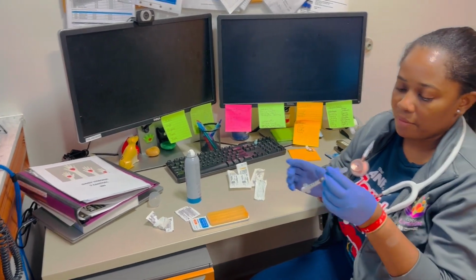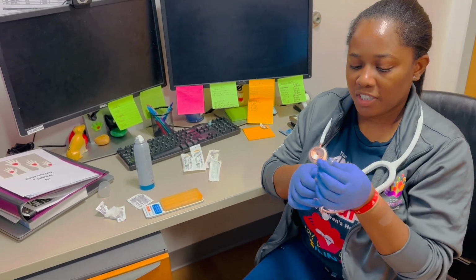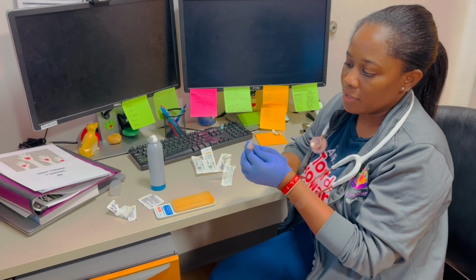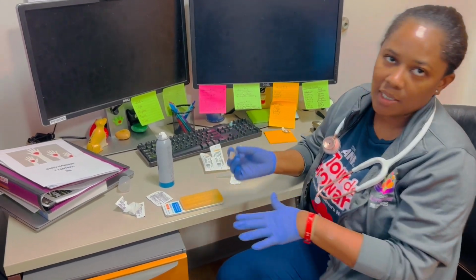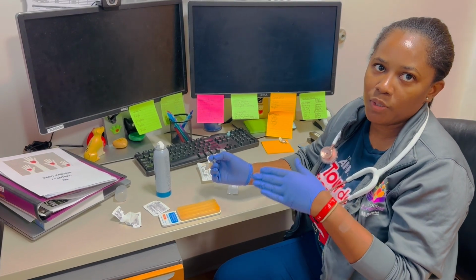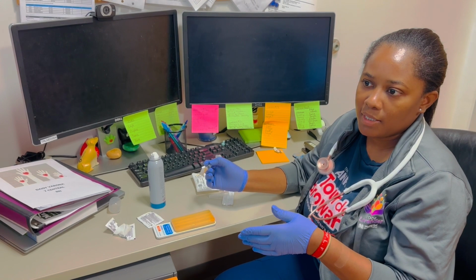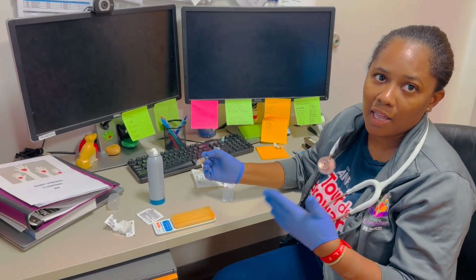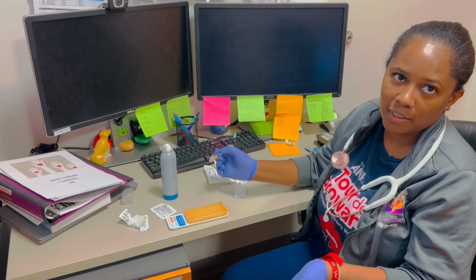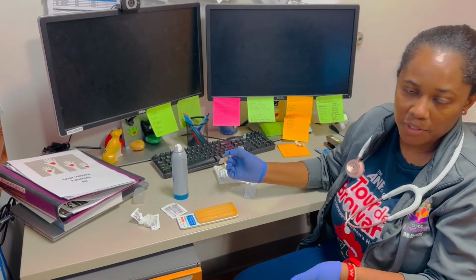So let's just say that I already have my medication on here. Just pretend that I do have my medication here. As you can see, this is a much smaller needle, so it's always going to be bevel up anytime that you do any type of injection. And for subcutaneous, you're always going to go at a good 45 degrees. If the patient is a lot bigger and has a lot of fat, then it's okay to go ahead and do 90 degrees. But for the most part, for subcutaneous injection, it's going to be around 45 degrees.